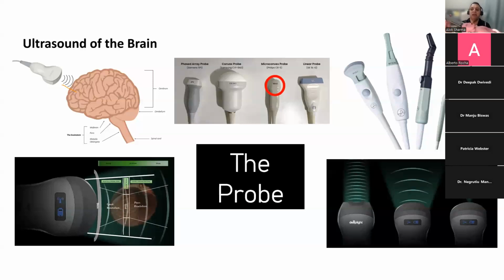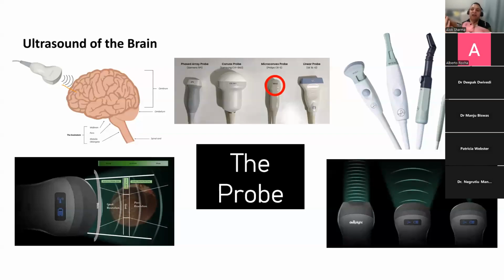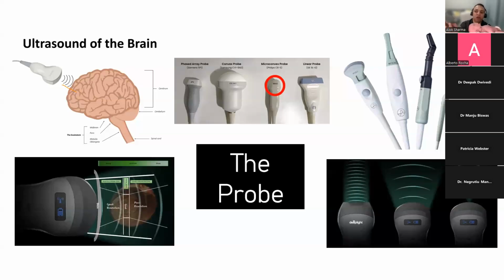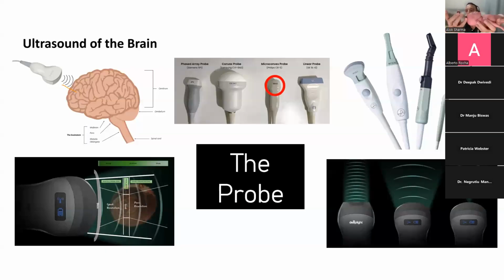And in a small baby, capturing those 6 images that you need for the coronal view, capturing those 5 images that you need for the sagittal view, the probe will just be all over the place. I want you to learn to hold the probe from the bottom. These two fingers, you can touch the fontanelle as you can see over here. You can press the fontanelle.